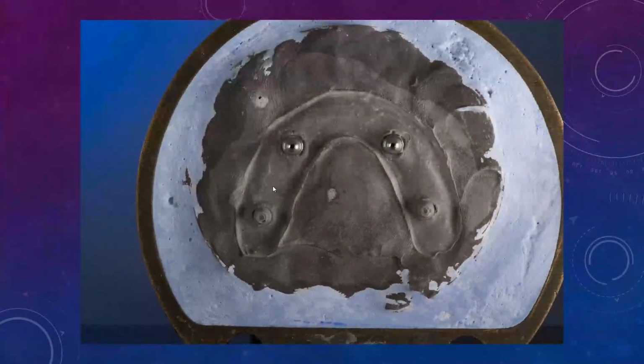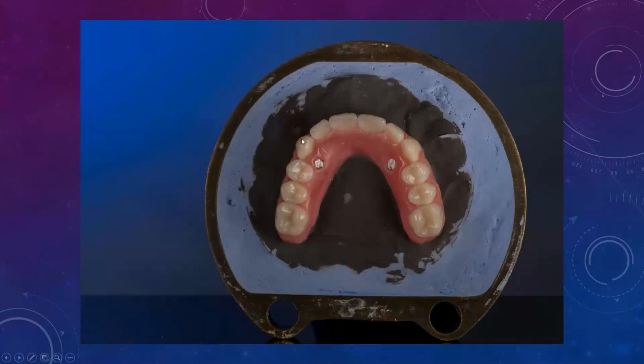I'll cover the teeth all the way to the occlusal surfaces and the incisal edges and just slightly wipe it so you can see just the tips of those teeth. It's a very important part when you're working with this type of tooth, because doing a second pour like this will allow you to deflask a lot more easily. When you're deflasking, it will open up like an envelope, because I'll just take a chisel and go from the very back and it'll open things up.